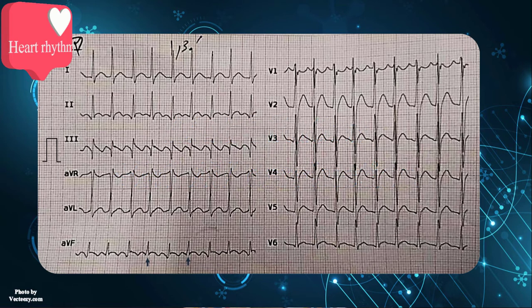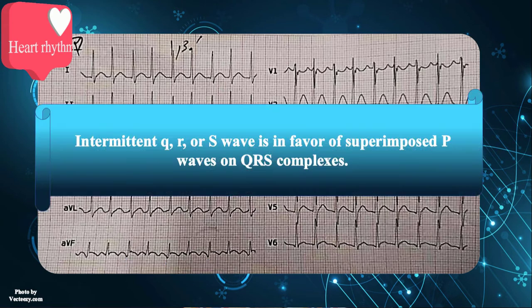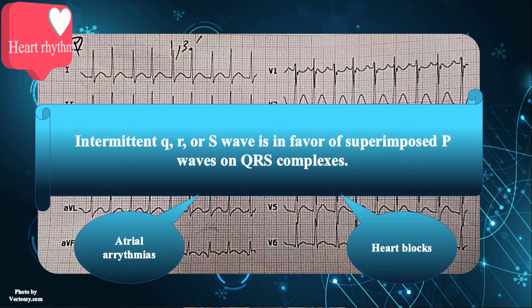The underlying rhythm is undoubtedly atrial flutter with 2-to-1 conduction. Note that some flutter waves are buried within QRS complexes and therefore are not visible. On the other hand, certain flutter waves are immediately before QRS complexes, forming intermittent pseudo-Q waves. As a general rule, intermittent Q, R, or S waves are in favor of superimposed P waves on QRS complexes and are usually observed in heart blocks or atrial arrhythmias, especially atrial tachycardia or atrial flutter.